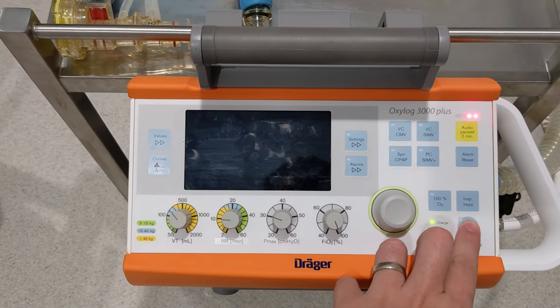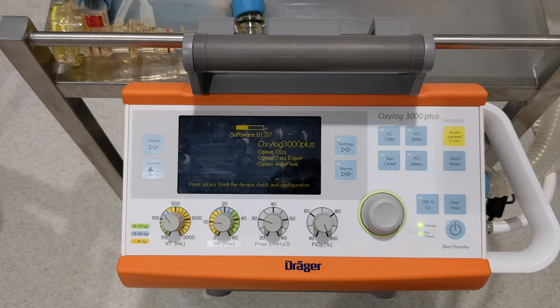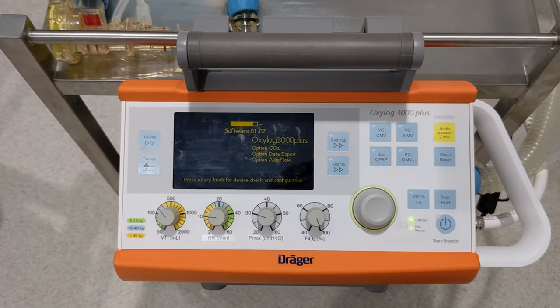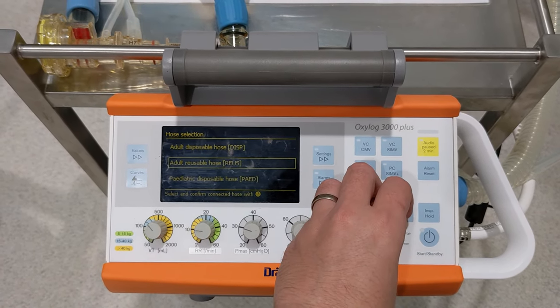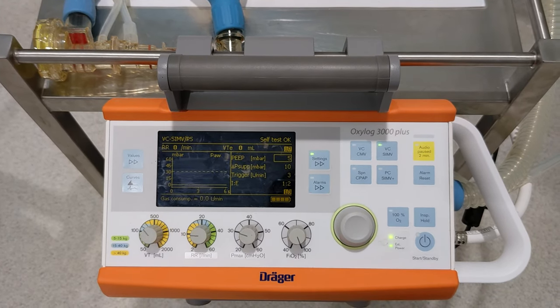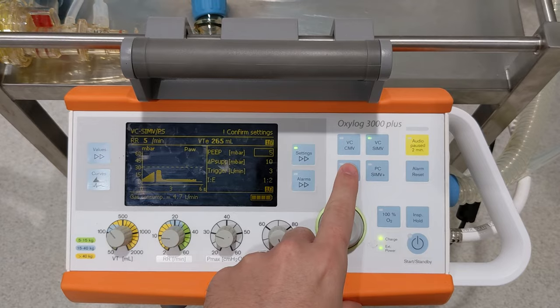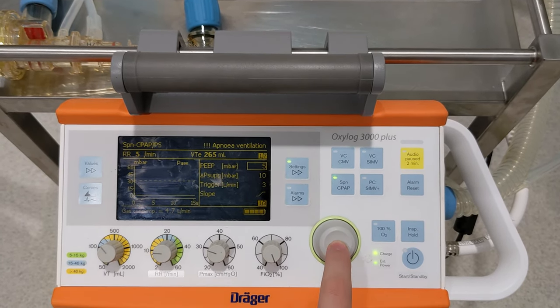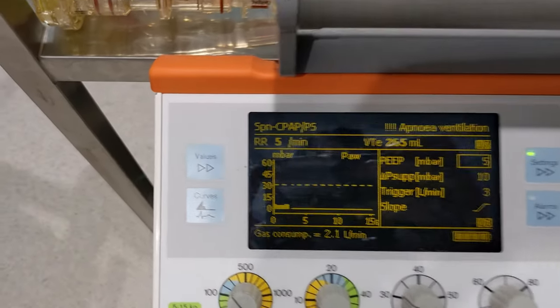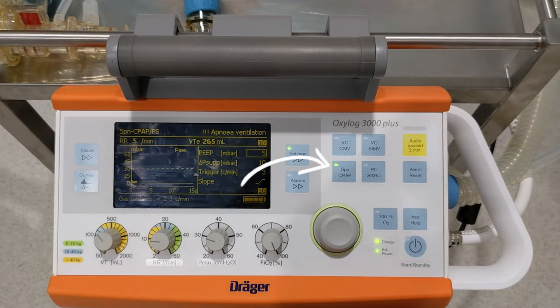Once your device is ready to go, the first step is to turn on the OxyLog by pressing the power button. It will run some quick self-checks, and then if everything is okay, will bring up the following screen. You'll need to select the type of hose or circuit that you'll be using. Today I was using a reusable adult hose, so that's what I selected. The machine defaults into VC SIMV mode, which will not work for non-invasive ventilation. To change the mode, we need to press the button marked SPN CPAP, and confirm the change by pressing the rotary knob. If done correctly, the setting will change in the top left corner, as well as the green light on the button.